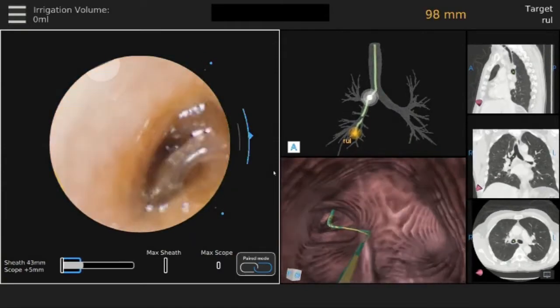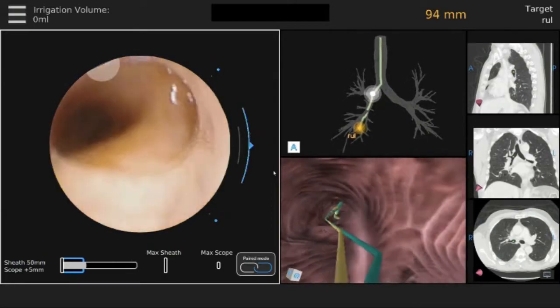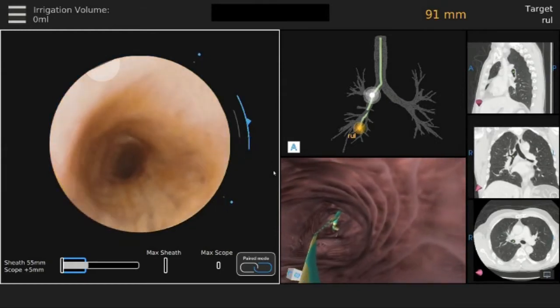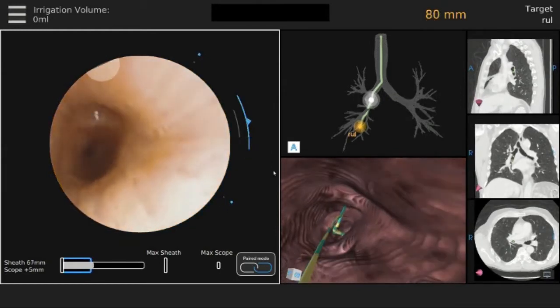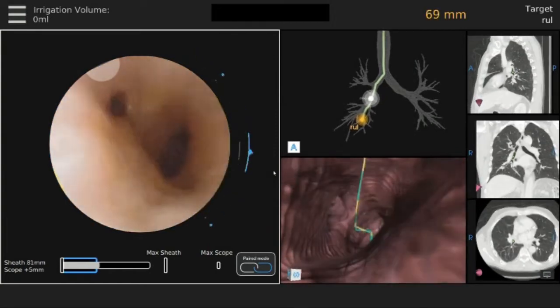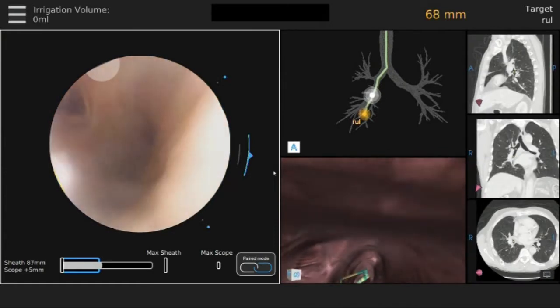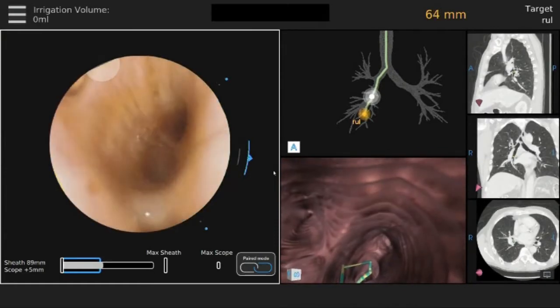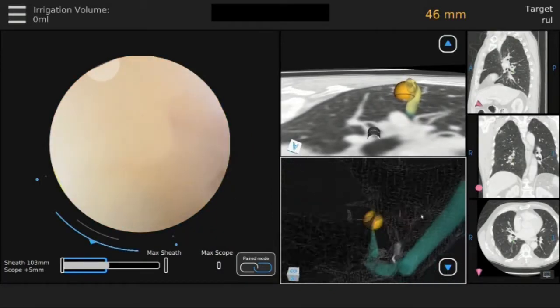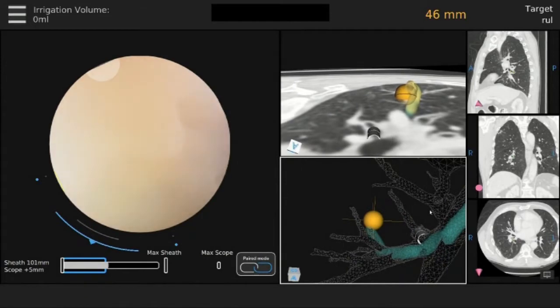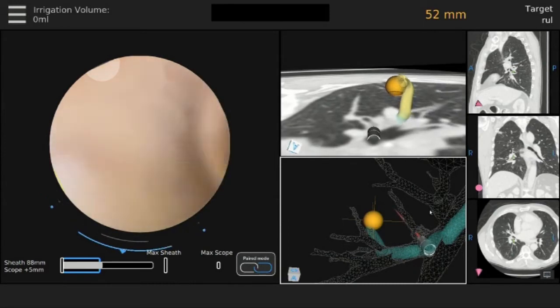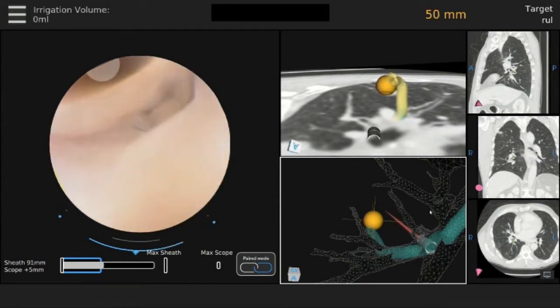This figure demonstrates the views present during the navigation portion of the procedure. There is a live bronchoscopic view. Three CT scan views are available, consisting of coronal, axial, and sagittal views. There are also two views for central navigation: the first shows the entire tracheobronchial tree, and the local views provide a single-slice CT scan depicting the target and its orientation to the target lesion.